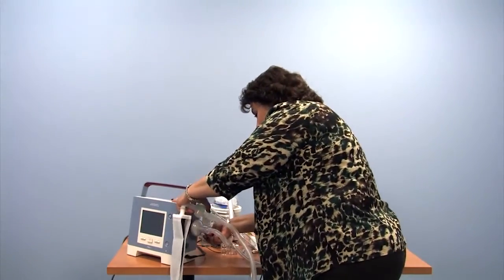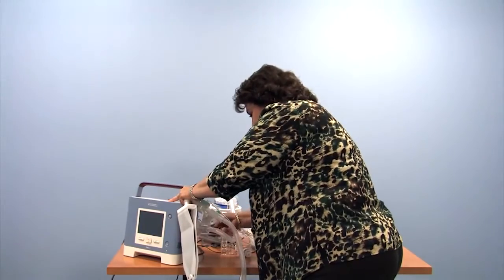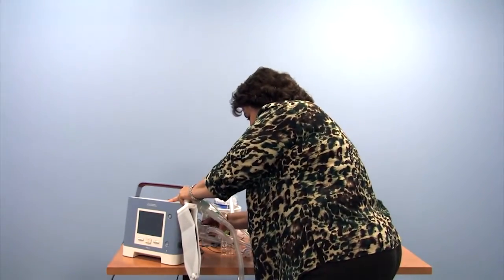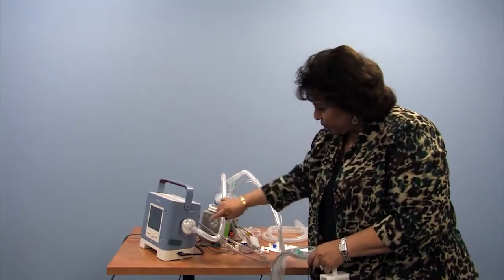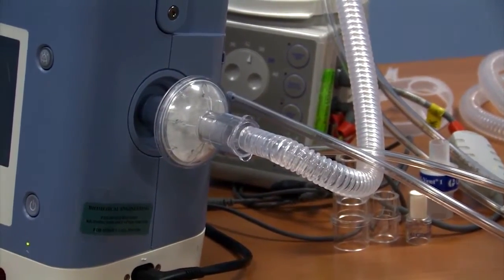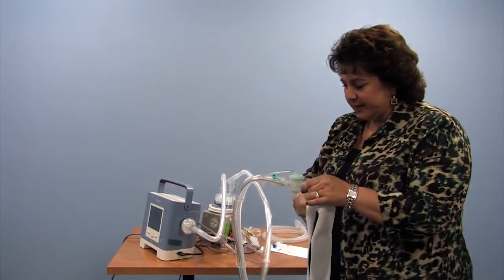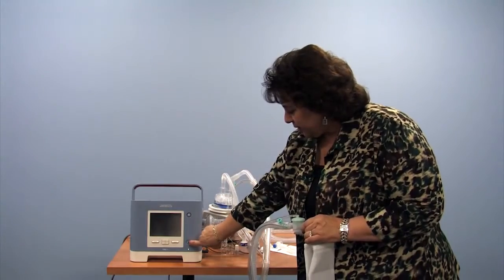On the machine, one is fatter than the other, and so they fit accordingly onto the two ports that I showed you earlier on the back of the machine. So we're talking about active circuit now because we have an active exhalation valve. I'm going to turn the machine on.